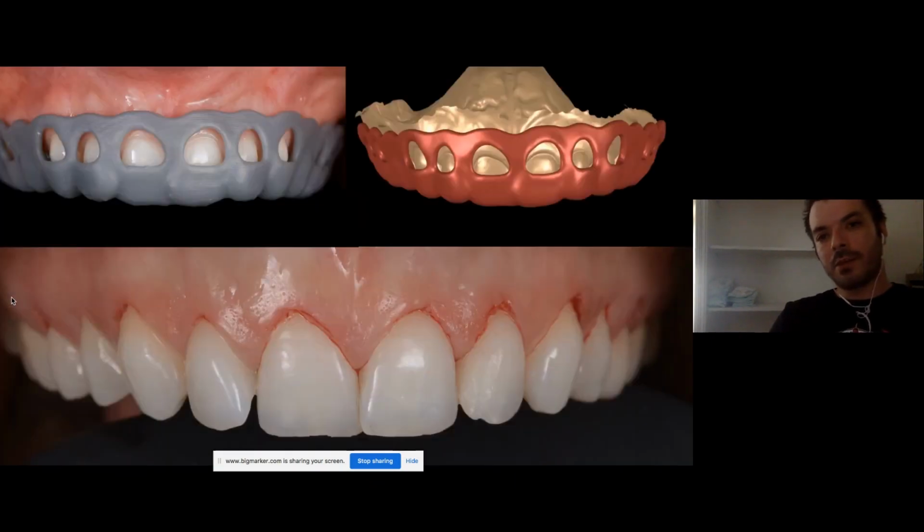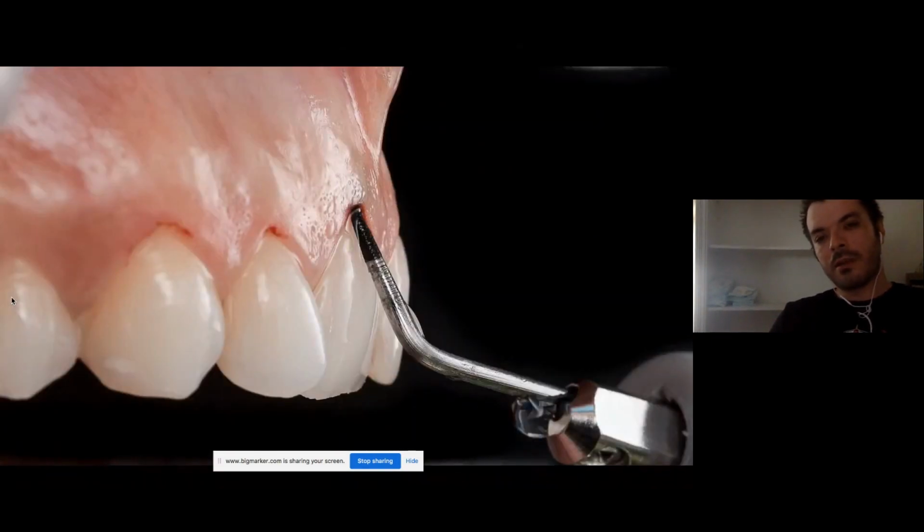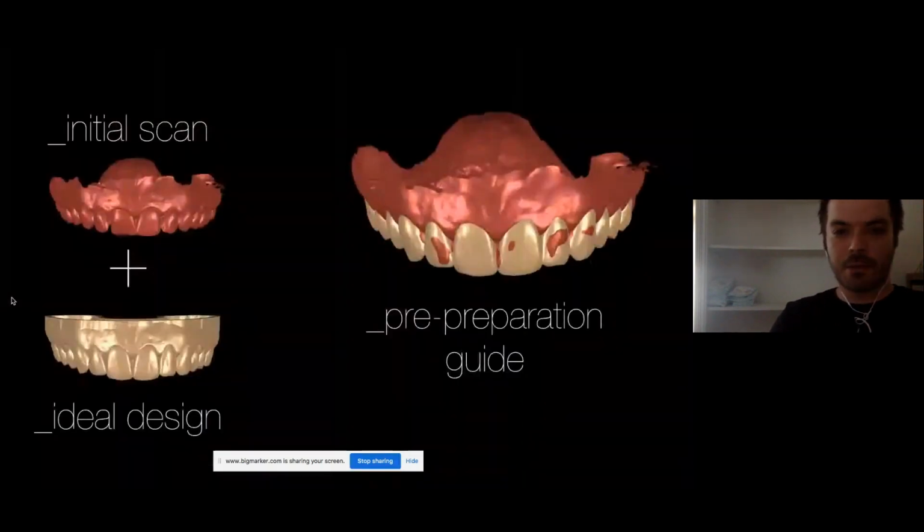So in this case, after we did the tissue, then we did the bone, we did it flapless. Long story short, there are two ways you can do the bone, with a flap or without a flap. Whenever bone is thin, we always like to do it without a flap. The huge advantage is that you can do the surgery and prep at the same time. And this we did 100% of the time in courses, because the course was 3 days, and we would always select cases that have the bone, a good indication for this.